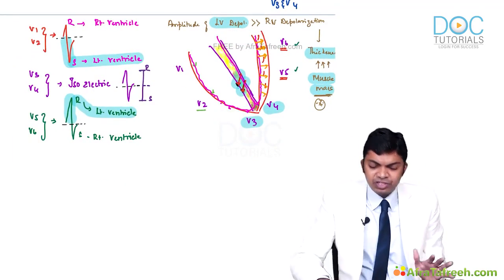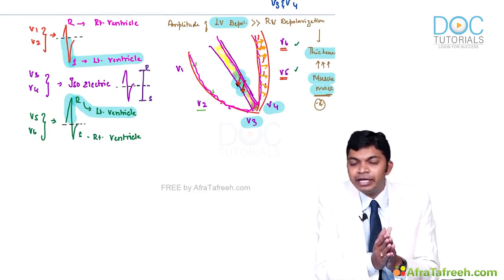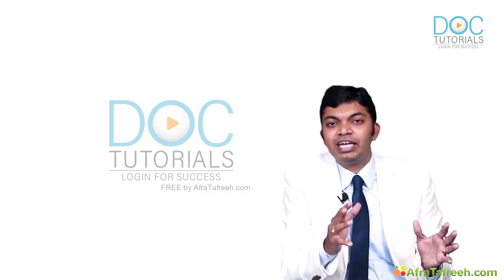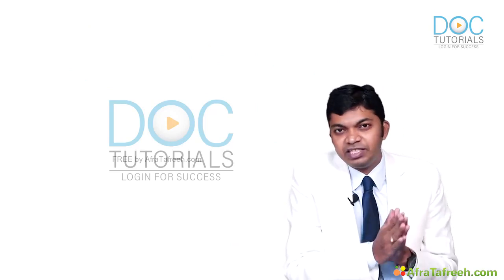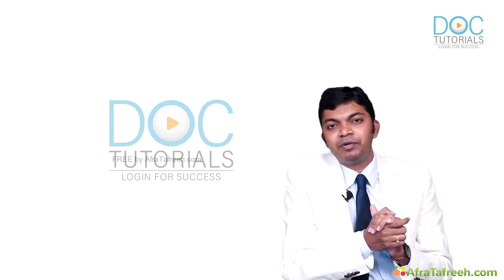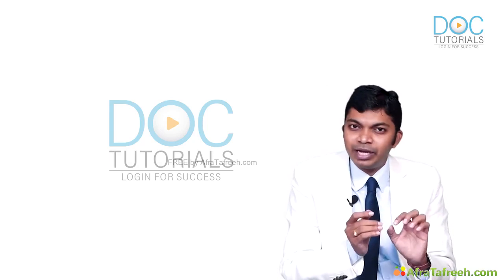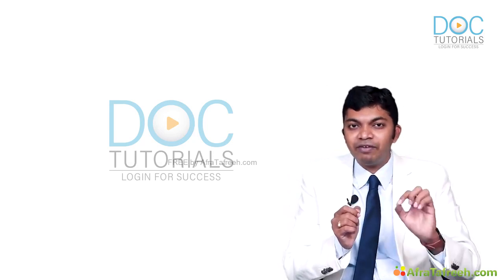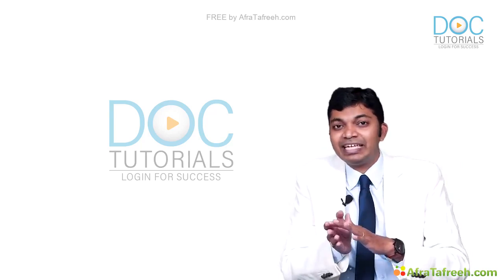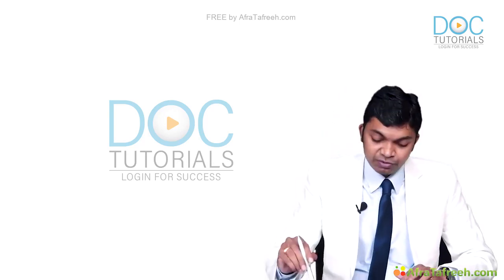So, the nutshell here is, doctors, if ECG shows S wave abnormality in V1, V2, R wave abnormality in V5, V6, this is a left ventricular pathology. If ECG shows R wave abnormality in V1, V2 and S wave abnormality in V5, V6, this is a right ventricular pathology. Remember, right ventricle is represented as R wave in V1, V2, S wave in V5, V6. Left ventricle is represented as S wave in V1, V2, R wave in V5, V6. These are all our waves of depolarization.